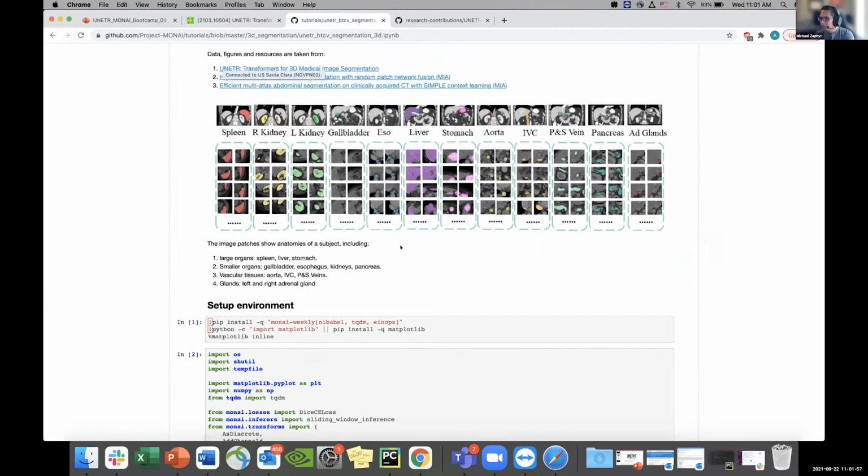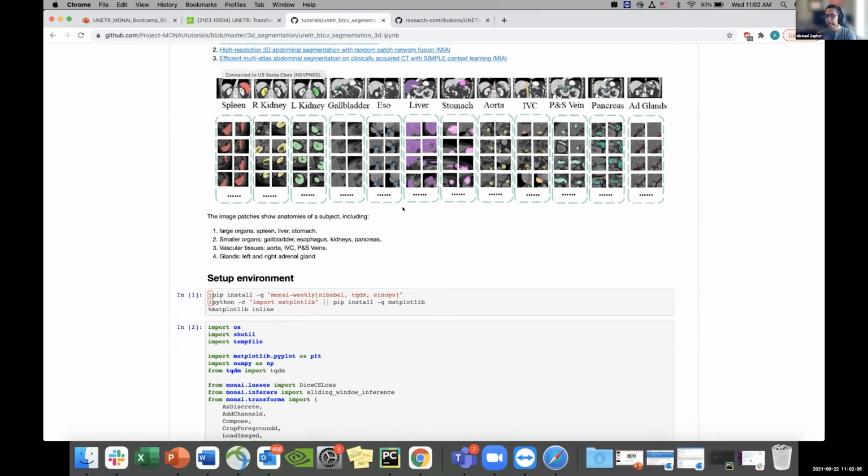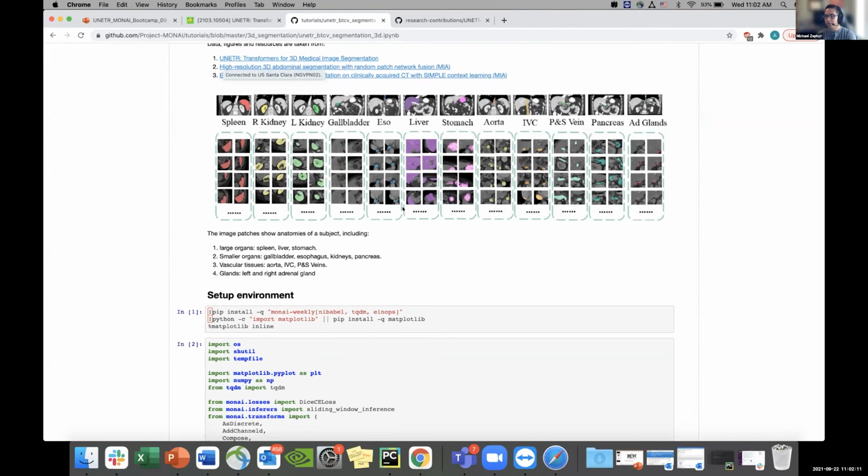Let's see. Since you are decomposing into 3D patches, can you do random affine transforms that would typically not make sense if you were dealing with the entire 3D volume? For example, rotating a heart 180 degrees so the aorta is facing down towards the feet in coronal view. Yes, that's a very good question. Once you extract the patches, you can just use the readily available transforms in MONAI, as we do also for some additional augmentation, and apply those to the extracted patches. So maybe that's one advantage of the model, which works on a patch level, which UNETR does.